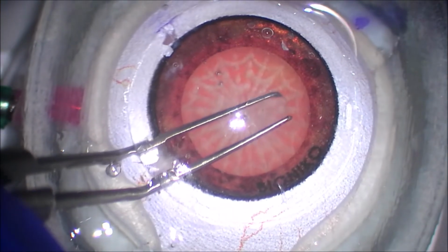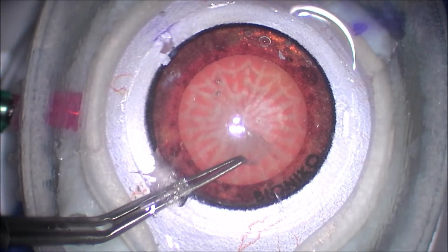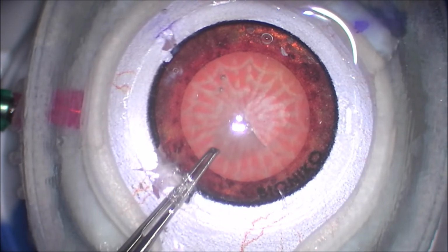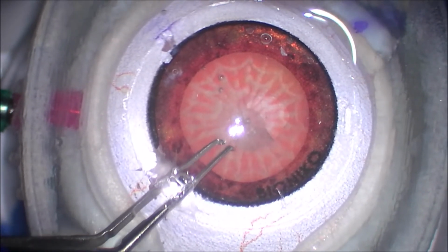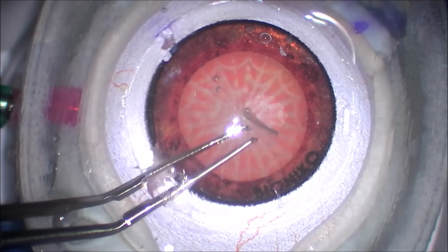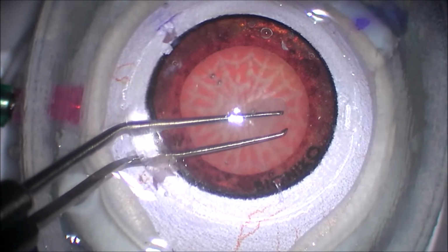So in this case, the video got cut off, and so she's already made the cystotome puncture, and now she's grasped and created a flap. You can see she's going clockwise here. And again, as far as the tissue simulation, it's not really quite like tissue because the flap wants to go back flat again. It's really stiff, and natural human capsule doesn't quite do that. It lays where it was left. And of course, there's a little bit of a challenge then having to re-grab when the flap goes back down.